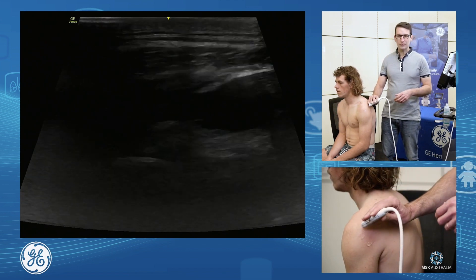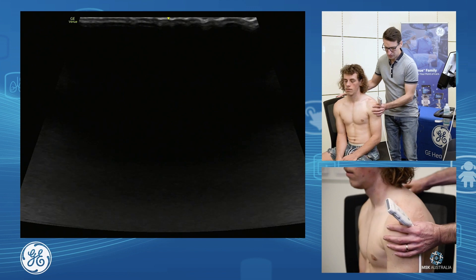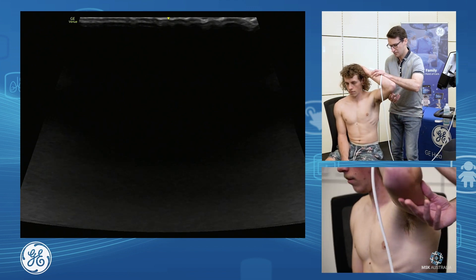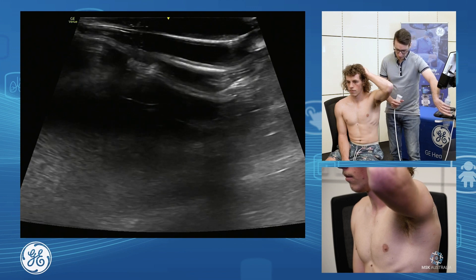Once we've assessed the back of the joint, we also want to assess our inferior joint capsule. So we're going to slide our patient around. I'm going to get the patient's hand on their head in a nice relaxed position, and add a little extra gel on my probe.